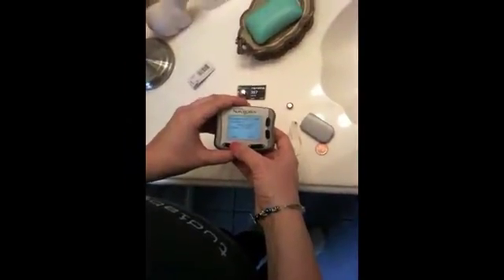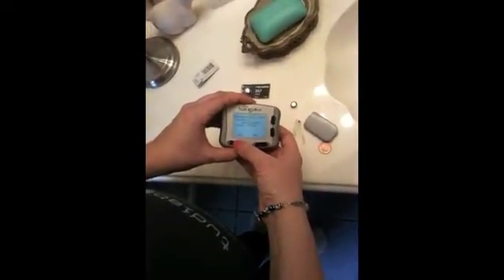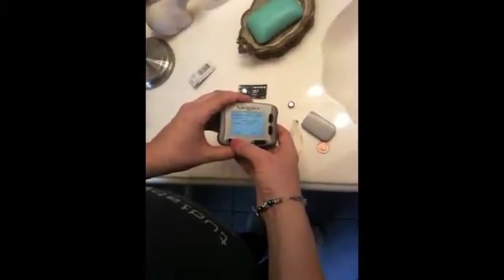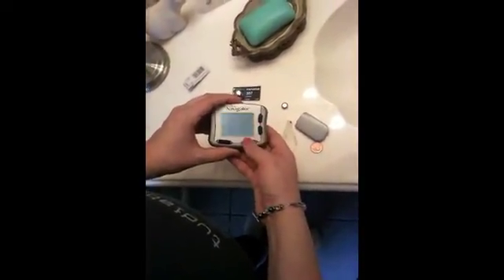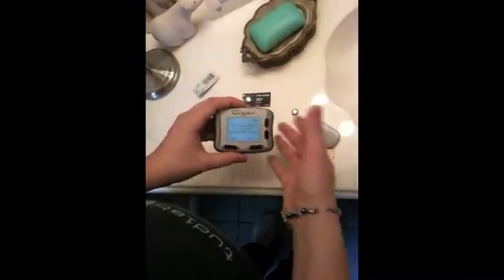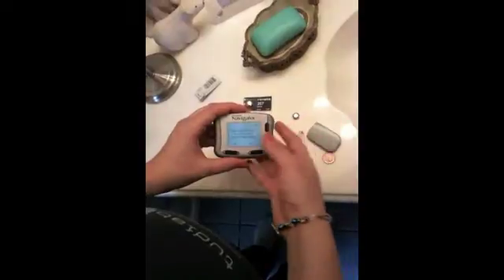Every time you put in a new battery, even if the battery is not at its full life, it will always show you that the counter has reset. So if you're using an older battery, you might not be able to know the full life of the battery.